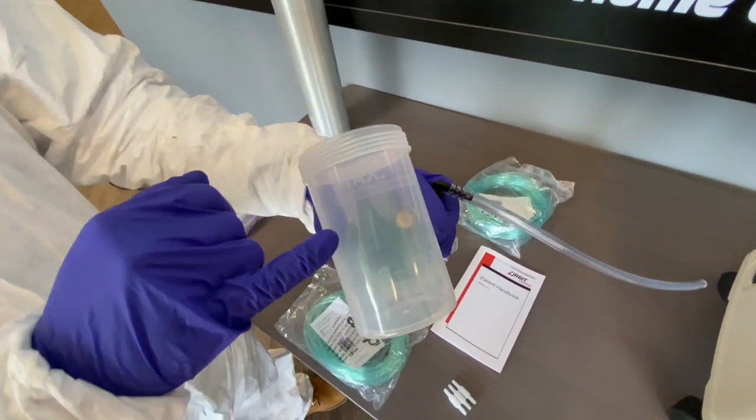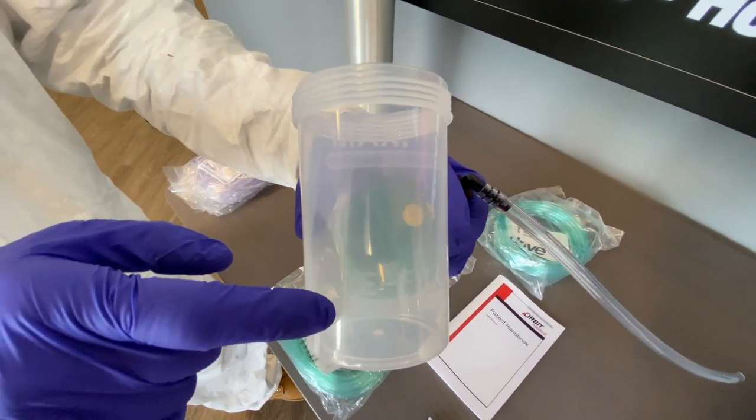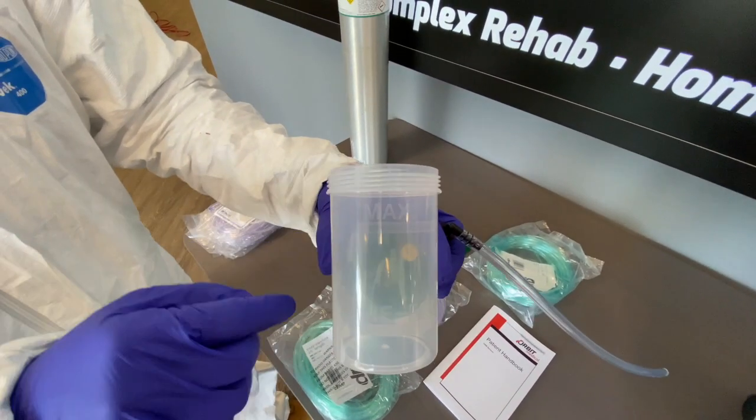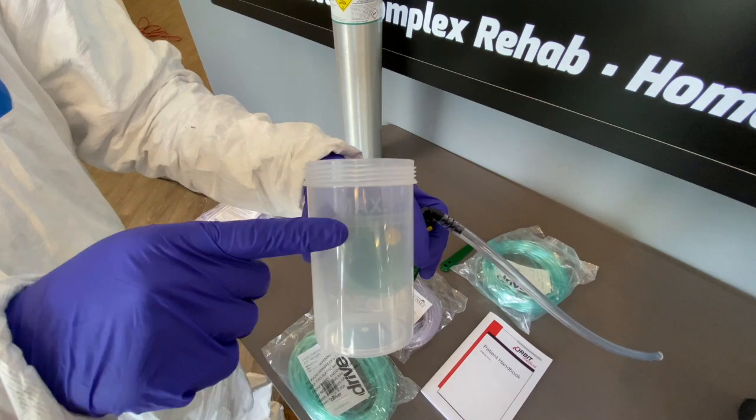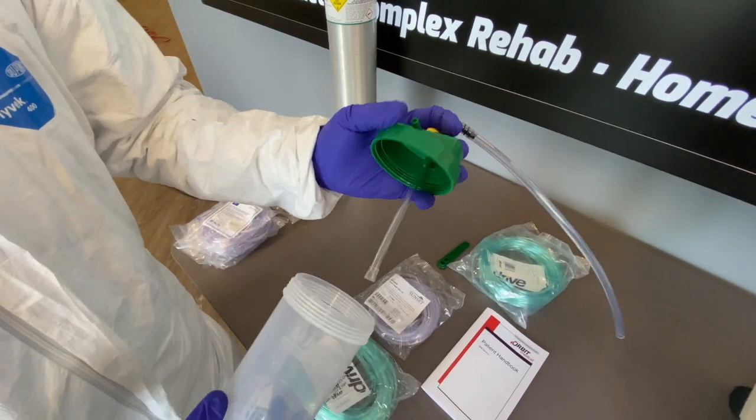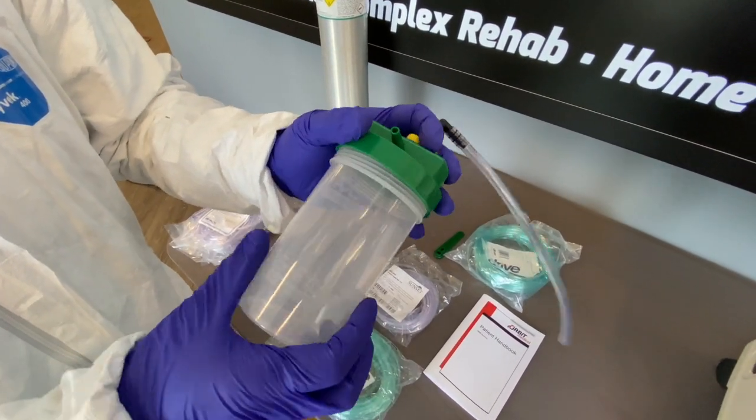I'll open this up to demonstrate — there's a max line and a refill line. You want to make sure that you don't overfill this cup; you want to stop right at the line. You also want to make sure that you're using distilled water.